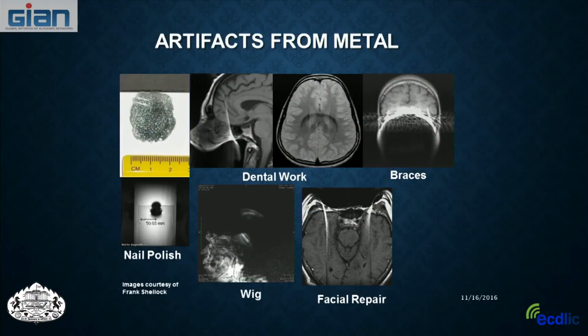Here is a person wearing a wig. I'm not sure what was in this wig, but you can see that you really can't see any of the brain in this case. And this was some kind of a facial repair here.